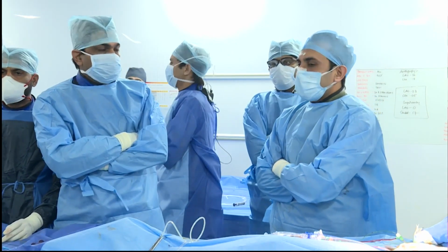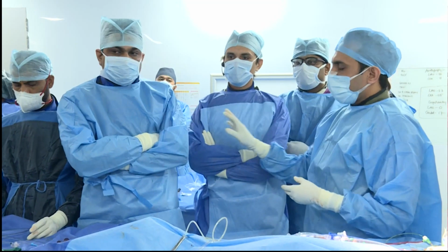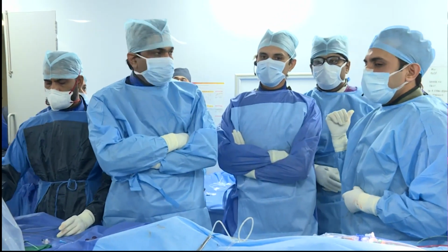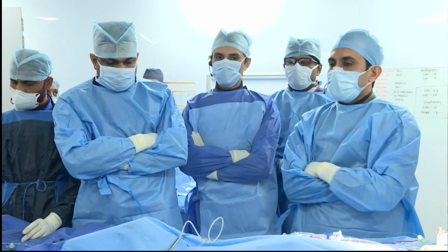Let's go to the case presentation. Before we start this case, let me introduce my team. That's me, my name is Ravinder. He is Dr. Kailash, Dr. Govind, and Dr. Vikram. He's our intervention structural fellow. He's going to spend 1 year with us learning all structural cases.